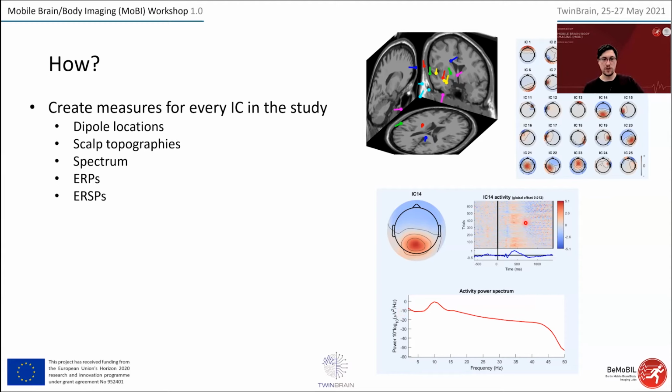You could also do ERSPs, so event-related spectral perturbations, if you want to go to the spectral analysis, but essentially it doesn't make a big difference. You have a functional measure, at least the spectrum is kind of a functional measure, and ERPs are definitely some sort of functional measure that you can also use for clustering. That's an issue, potentially. I'm coming to that.